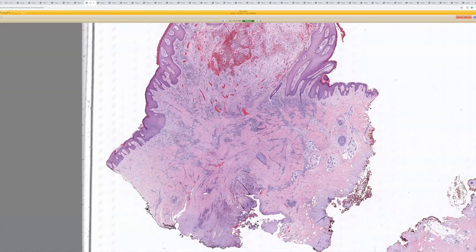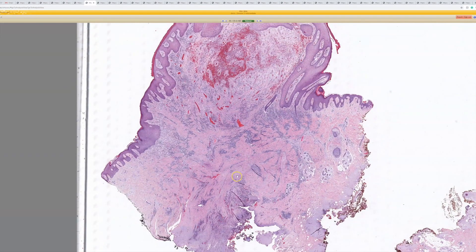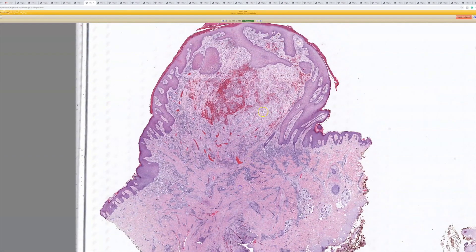It's in the midline gluteal cleft, right around the coccyx area. That's basically the way I recognize these. You've got to have the right location, and then if you have granulation tissue and it's in that location and clinically they want that, that's probably what it is.